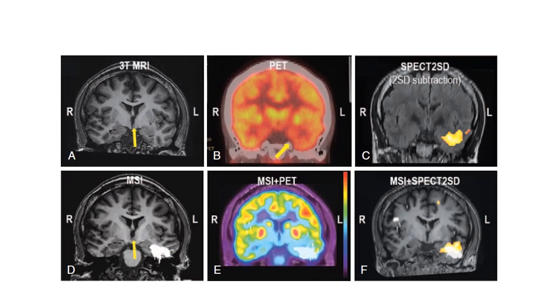MEG, 3T MRI, and indirect functional methods, PET and SPECT, were completely congruent in revealing a very active left anterior temporal irritative and ictal zone. Because evidence suggests that removal of brain regions containing MEG clusters leads to a favorable surgical outcome, and the patient has already failed radiosurgery, it remains to be seen if this patient will need an operation in order to attain seizure freedom.